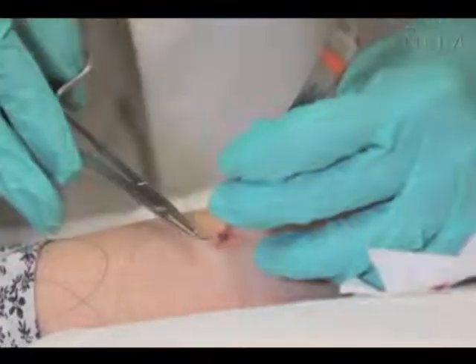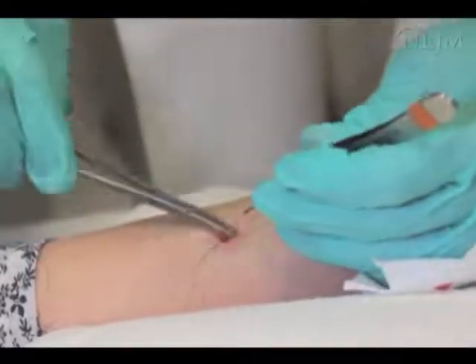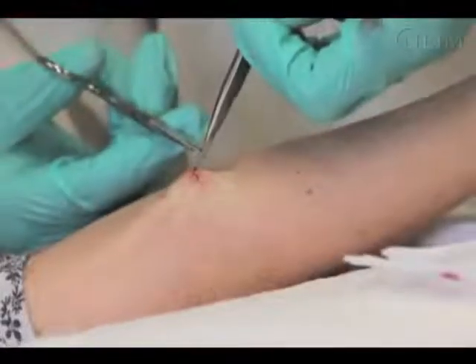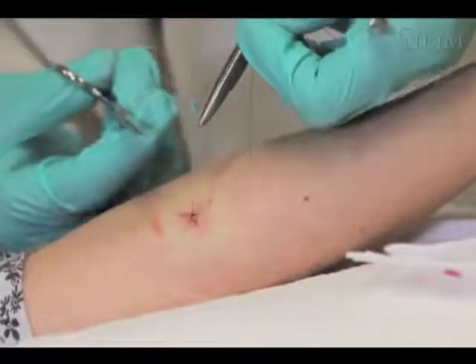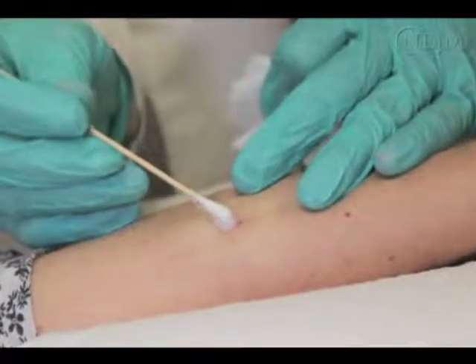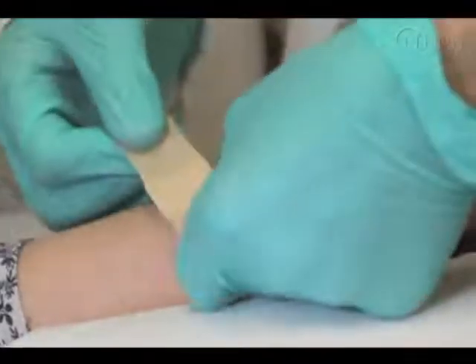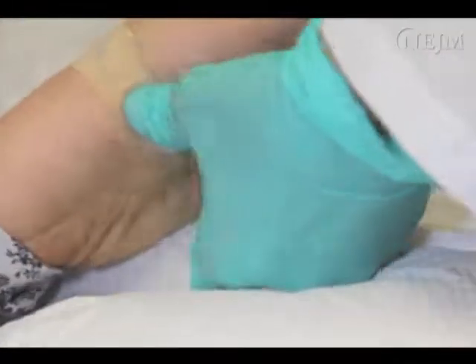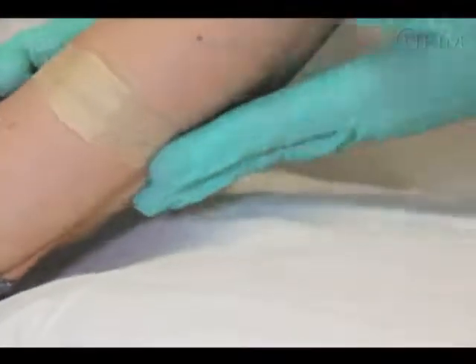Since a punch biopsy involves obtaining a sample of the full thickness of the skin, epidermal and dermal evaluation is possible. It is easy to learn how to perform a punch biopsy, and the procedure has a low risk of causing clinically important scarring, bleeding, or infection.